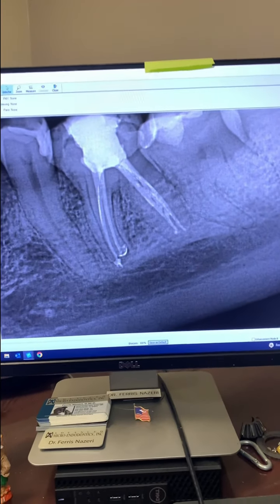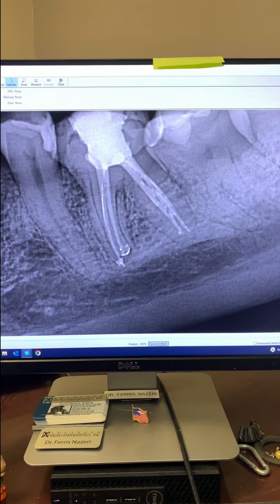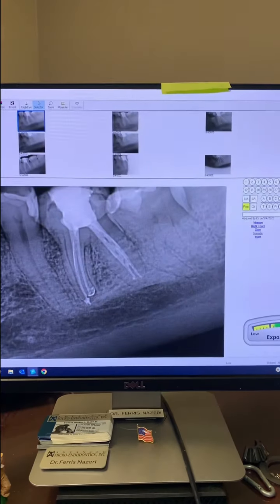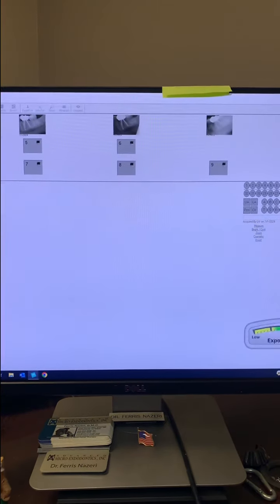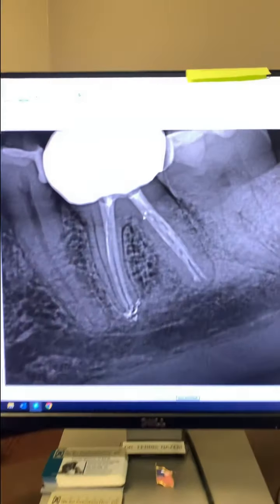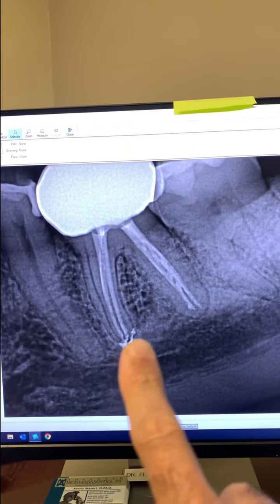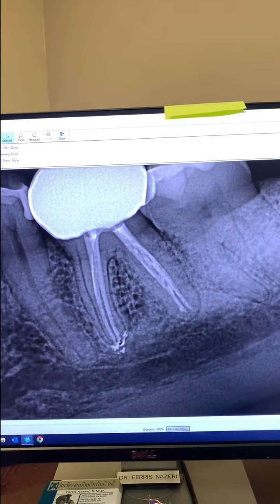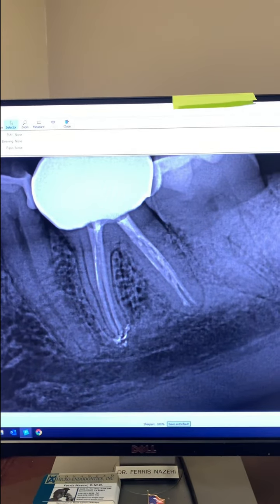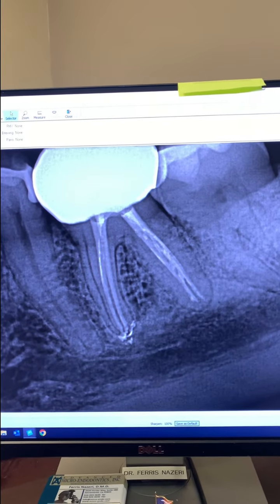Well, patient came in today for a different tooth. So we always take x-rays of the teeth that we worked on previously just to make sure they're doing okay. Let me show you the 2 years post-op of the tooth. Tooth has a crown on it now. Periapical lucency is healed. Tooth is in full function. Patient is happy. That's why she came back to see us. So 2 years post-op of tooth number 19.